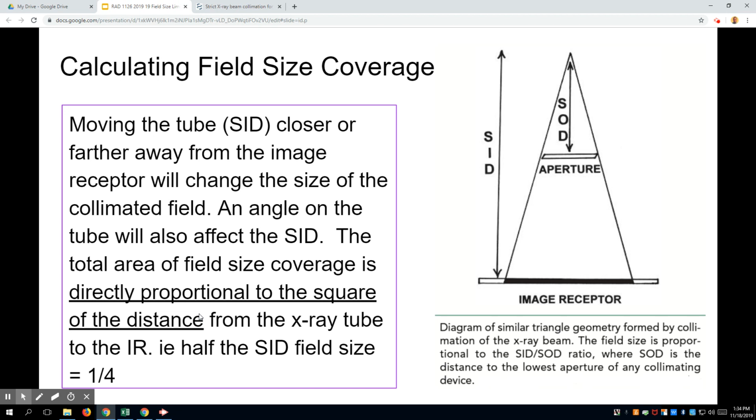beams and parallel cassettes and things. But people get scared anyway. But I think you have to ask yourself again, could I have collimated more? And then try to. I also want to say that if the anatomy is not centered on the receptor, then, right, so yeah, that's actually the answer to the question.